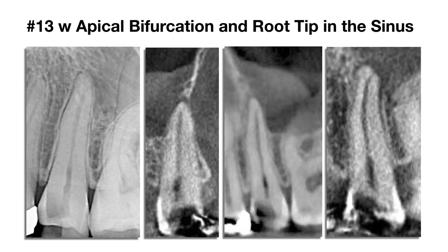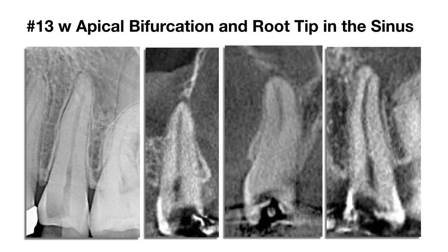It's ironic. And here's a really nice, crisp, sharpened view where you can see the apical bifurcation of the canal. And the longest part is actually the smaller part. We'll see which one my file decides to go into. And then here's yet another view. This root has a single canal. It has a fairly good shape. It's a young man, and so I'm going to be doing just minimal shaping here. Probably bring in the 1806 Traverse rotary negotiating file and see if that gets us to length. Okay, I'll catch you on the other side of the glass wall.